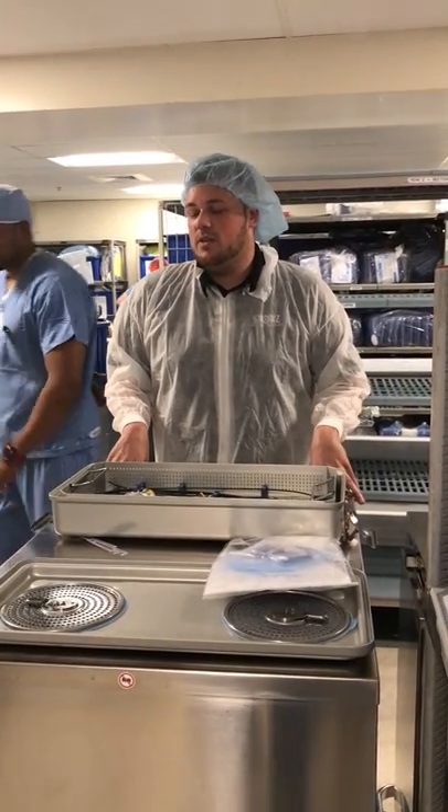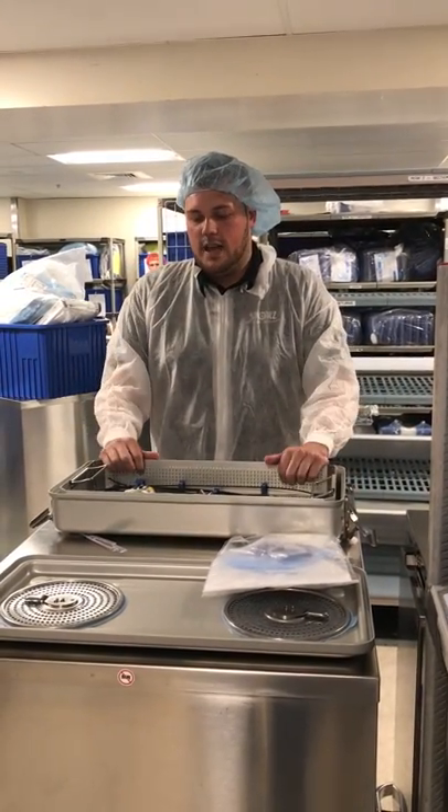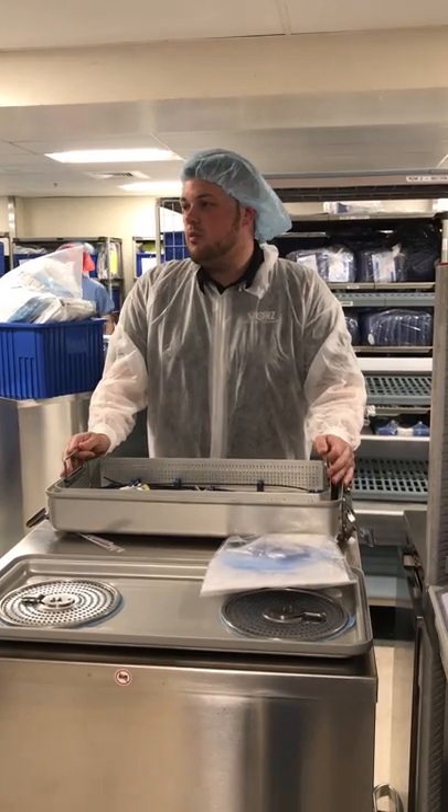I'm from Build Service Tech for Carl's. I deal with anything repair or service related and we're here today to introduce the new video ureteroscopes.